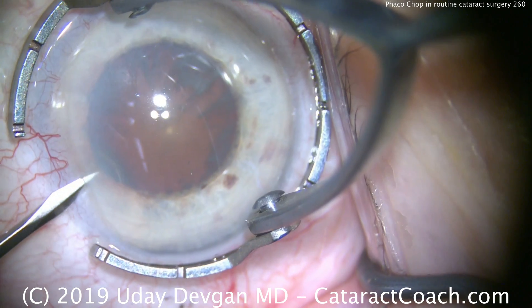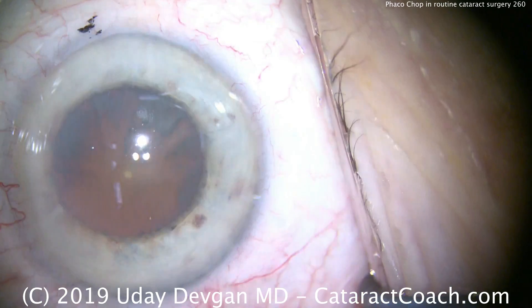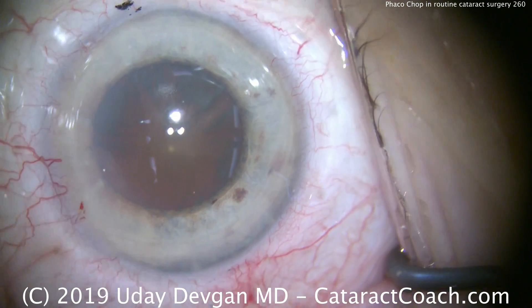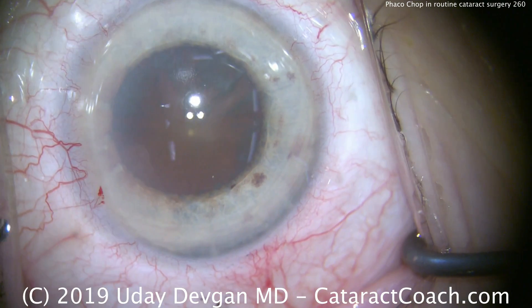Look at the eye in comparison to the fixation ring — you can tell this is a small eye. Small anterior chamber, the patient's hyperopic, and the white-to-white diameter of the cornea is small.